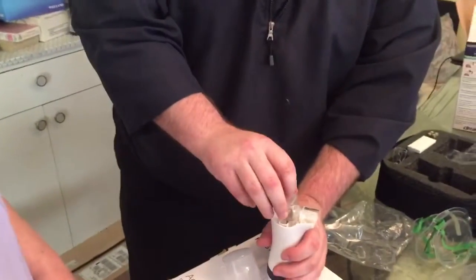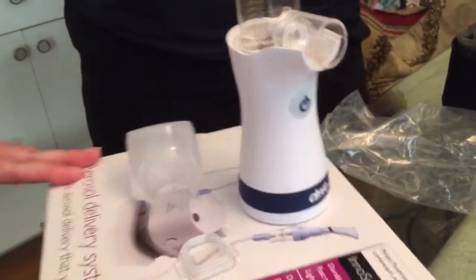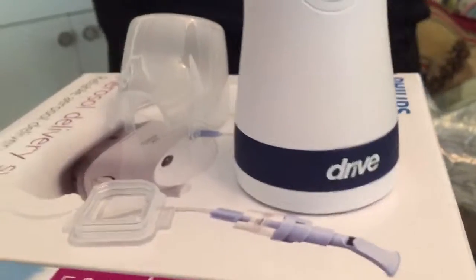Just fill up that well in there to the top. This is the first time you've seen this kind? Yes, this is the first time I've ever seen this. Is this the best of the best? I can't give you that answer — I've never known of anybody even using it; you're my first patients to receive this kind of nebulizer.